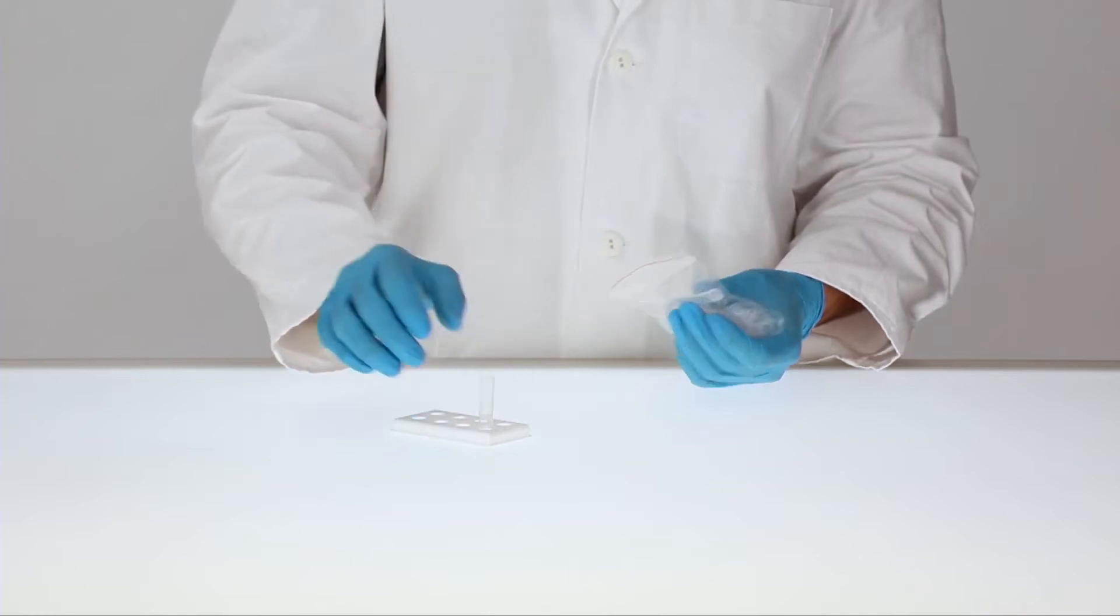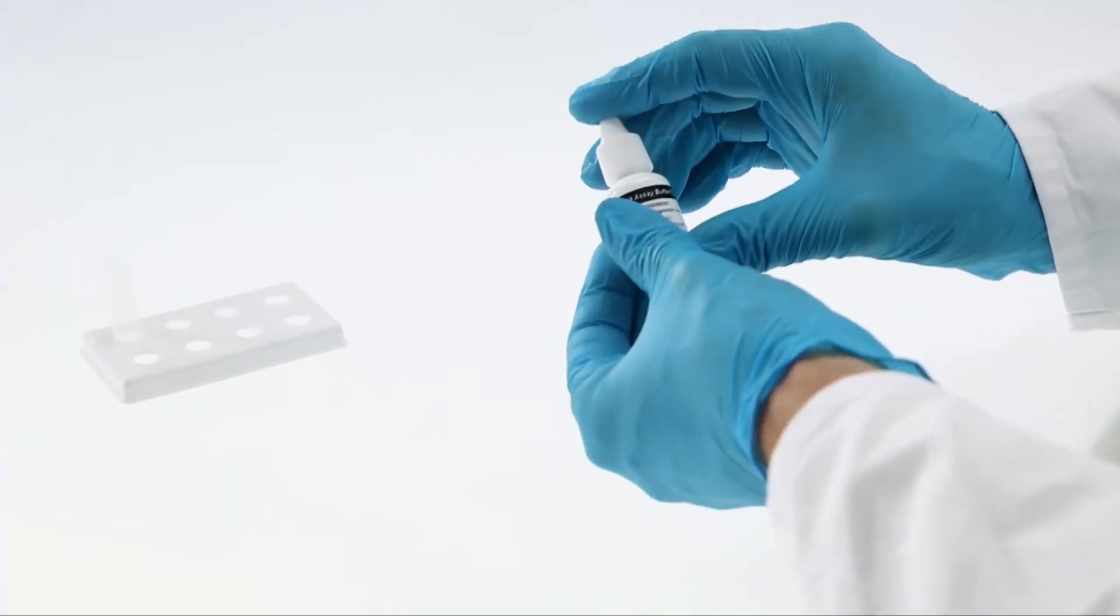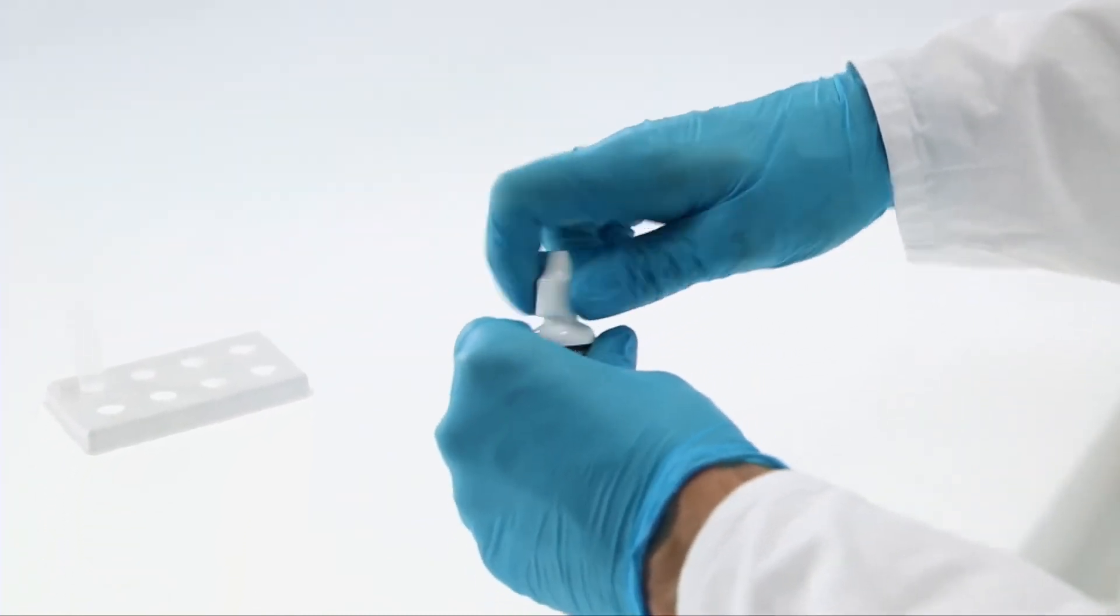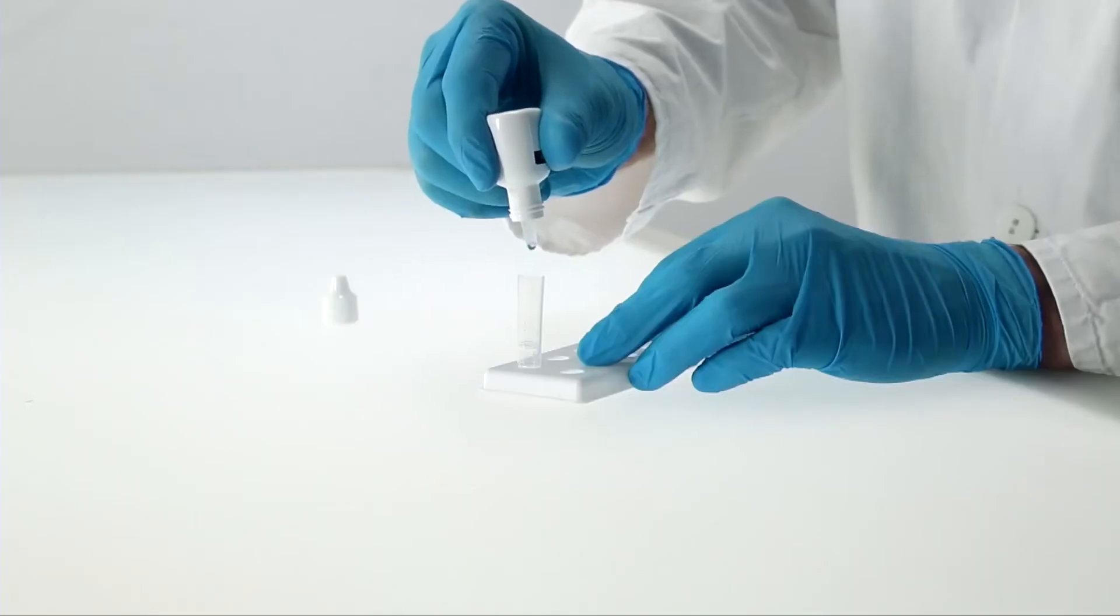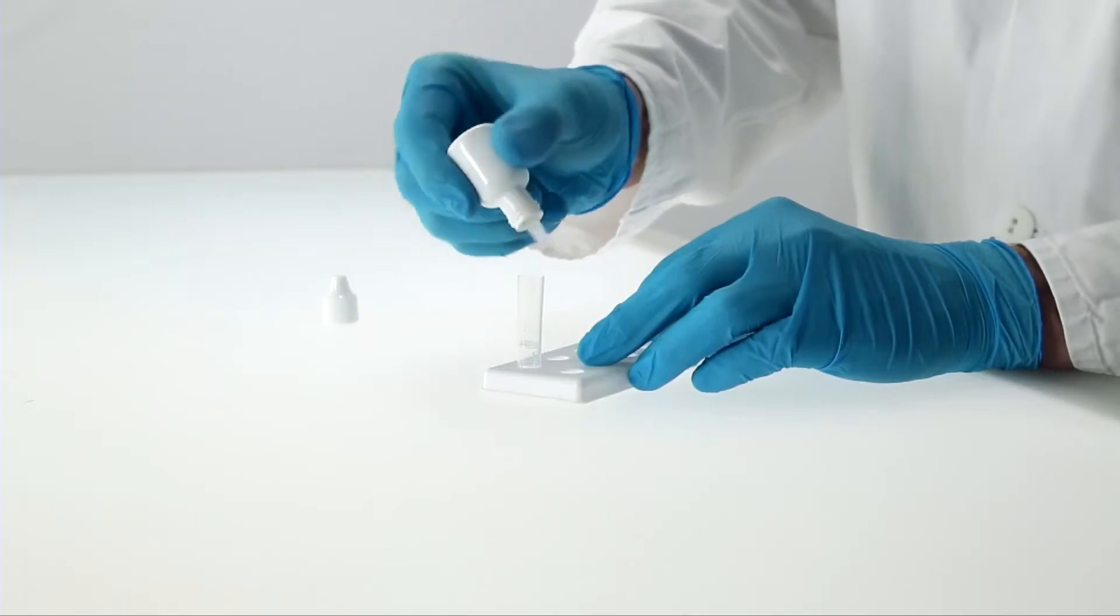Place a clean extraction tube into the reagent holder. Gently mix the buffer by carefully swiveling the bottle. Make sure to hold the buffer bottle vertically and add 10 drops to the extraction tube.